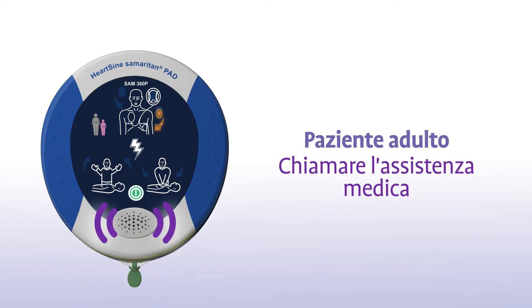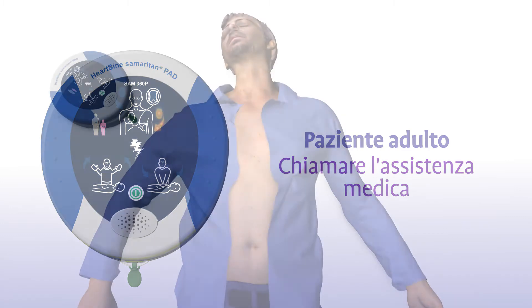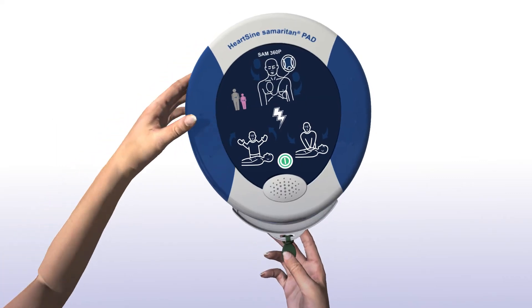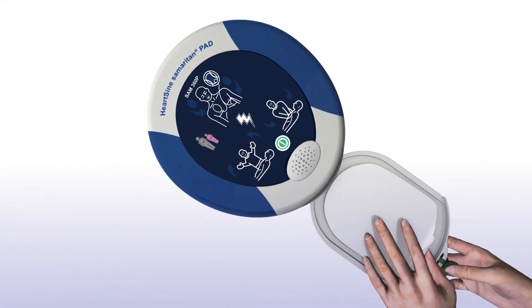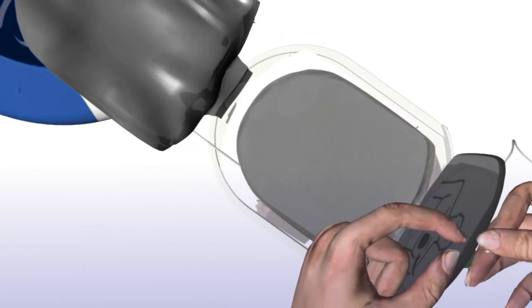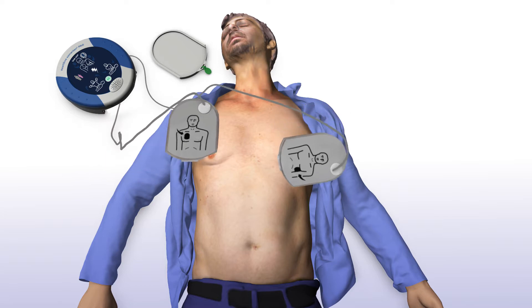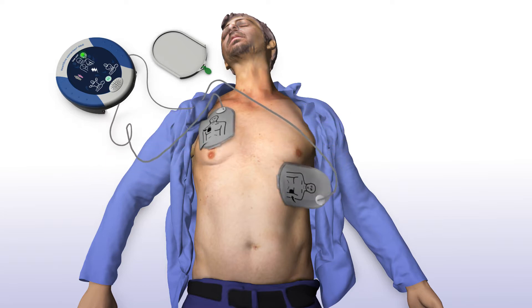The device will prompt: "Paziente adulto. Chiamare l'assistenza medica. Rimuovere gli indumenti affinché il torace del paziente sia nudo. Tirare la linguetta verde per rimuovere gli elettrodi. Staccare gli elettrodi. Applicare gli elettrodi sul torace nudo come mostrato nella figura. Premere saldamente gli elettrodi sulla pelle nuda del paziente."